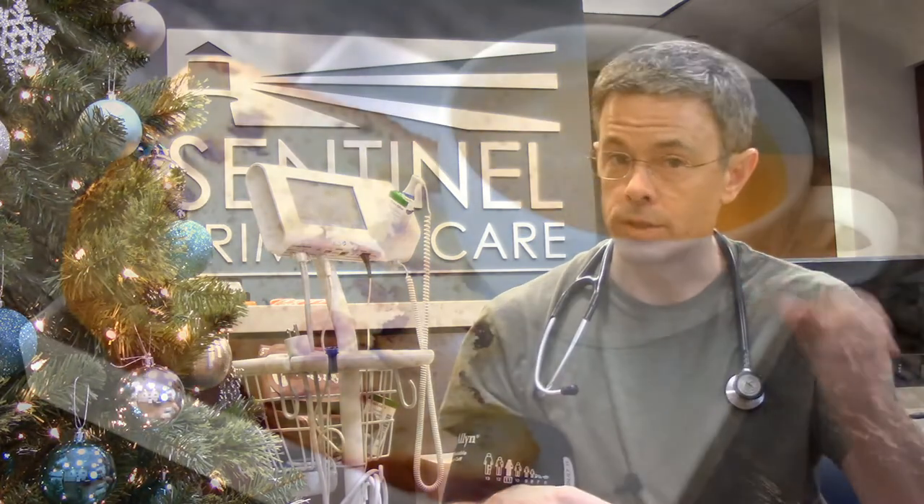Number one: preparation. The guidelines recommend that for 30 minutes before you check your blood pressure, you do not exercise, you do not smoke, and you do not have caffeine. So maybe don't check your blood pressure while you're sipping on your cup of coffee.